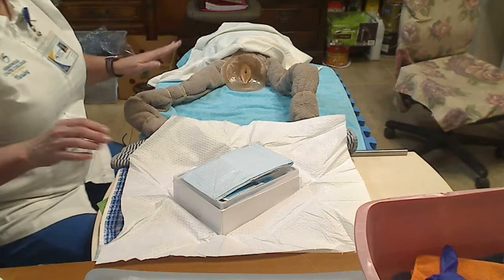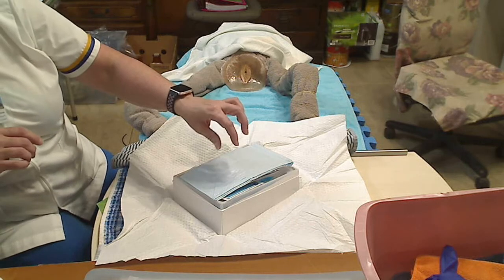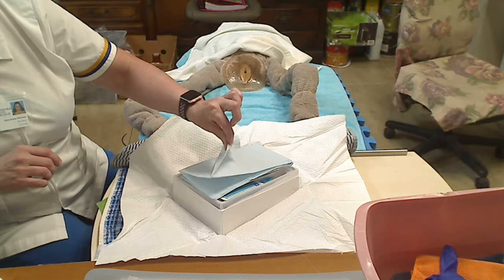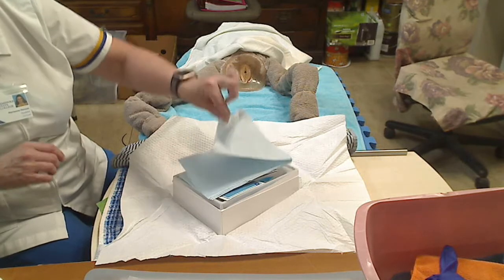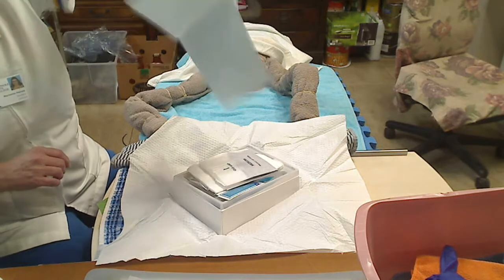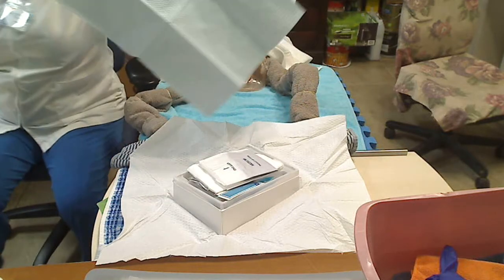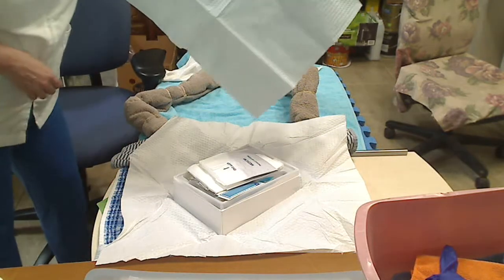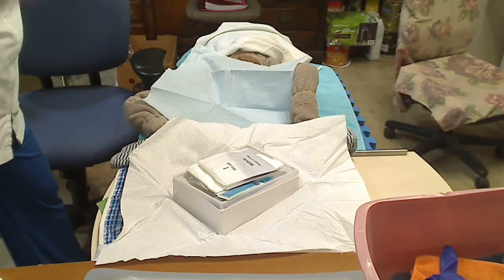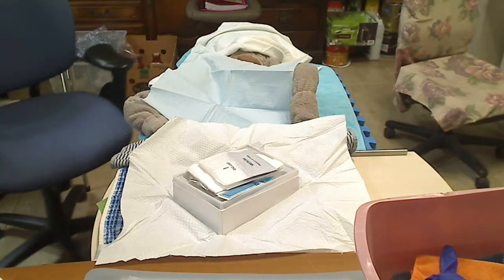Okay, so from here I am going to pull out my first drape. There's two sides to it. This side, which is the shiny side, goes down. This is my waterproof pad. So I'm going to touch it on the corner, lift it, open it, come towards her head. My table's in the way. And I'm going to drop it down. It's not dropped in the correct position, but I absolutely cannot touch it now because it is sterile. I apologize, my house is too small.